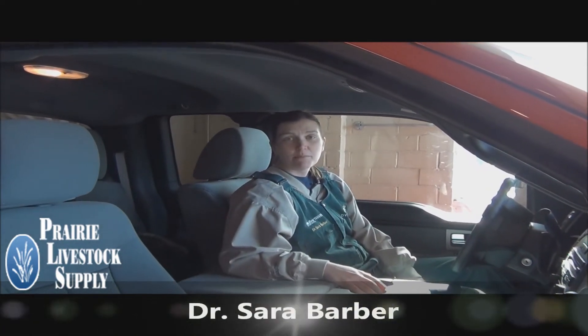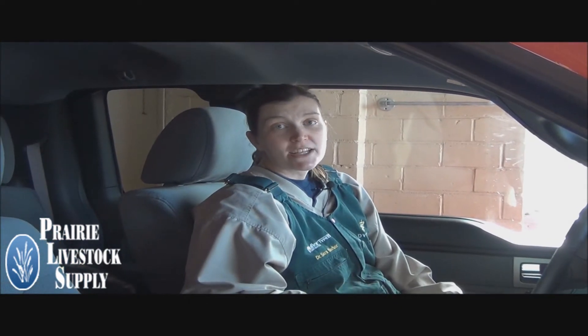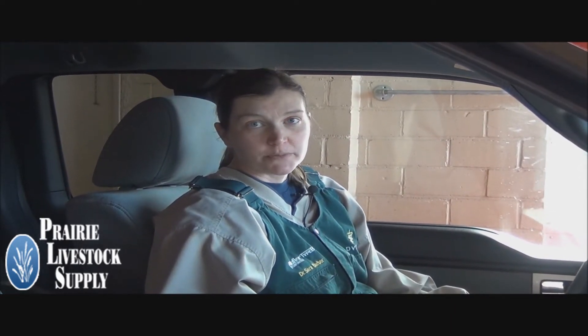Hi, my name is Dr. Sarah Barber and I'm a veterinarian at the Veterinary Medical Center and Prairie Livestock Supply. We are passionate about helping our clients succeed in improving the health of their animals. Today I want to show you a tool called the BRICS Refractometer, which we use to measure the quality of colostrum.